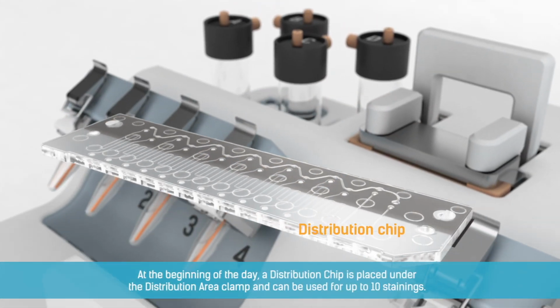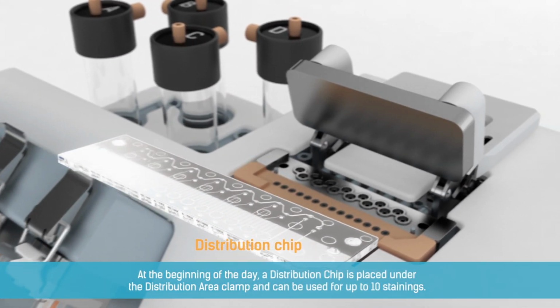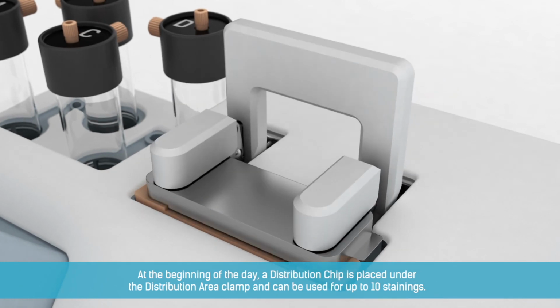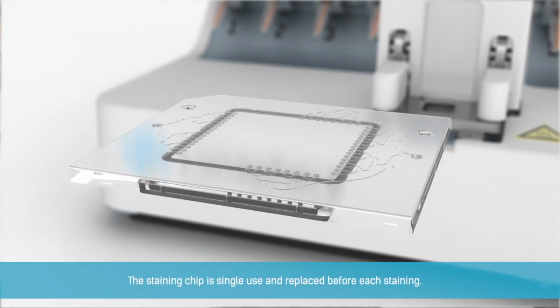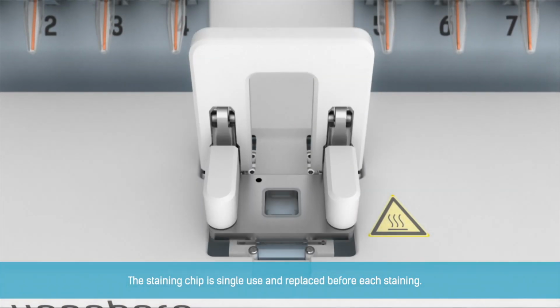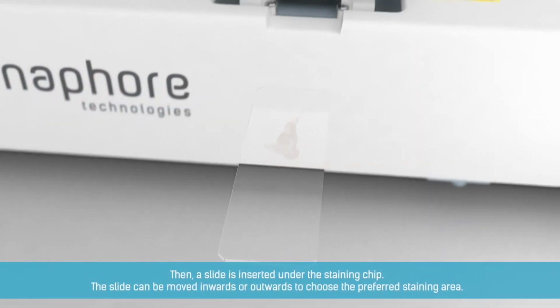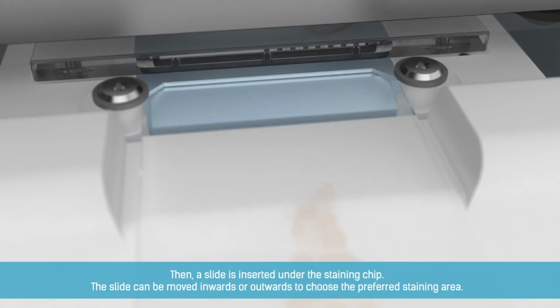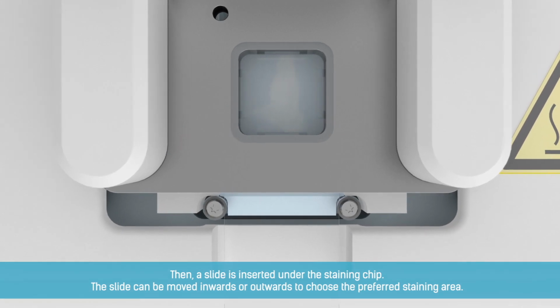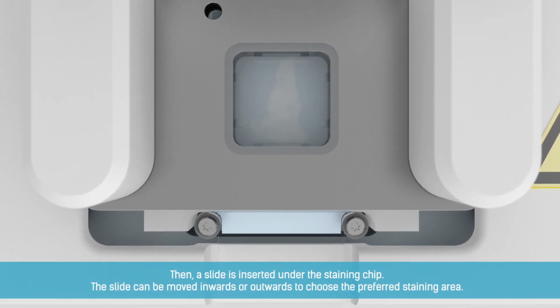At the beginning of the day, a distribution chip is placed under the distribution area clamp and can be used for up to 10 stainings. The staining chip is single use and replaced before each staining. Then, a slide is inserted under the staining chip. The slide can be moved inwards or outwards to choose the preferred staining area.